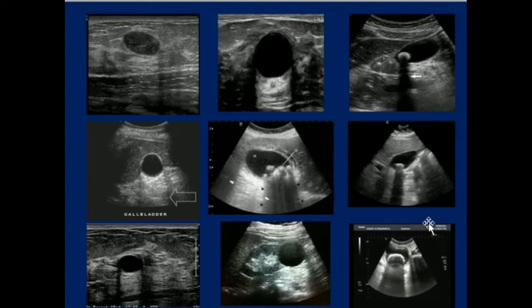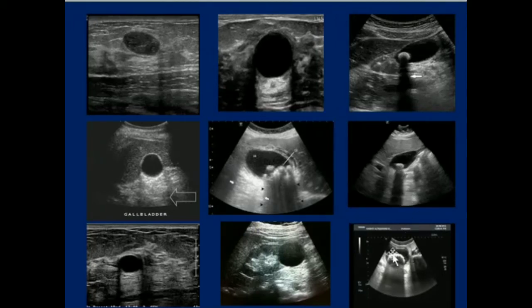Now moving to posterior shadowing. In this image there is a stone lying within the lumen of the gallbladder, and this is causing posterior shadowing. Another stone also causes posterior shadowing. This is the urinary bladder containing a large stone, and it is also showing posterior shadowing.